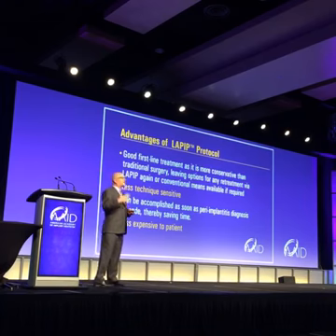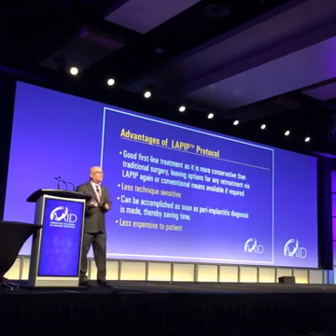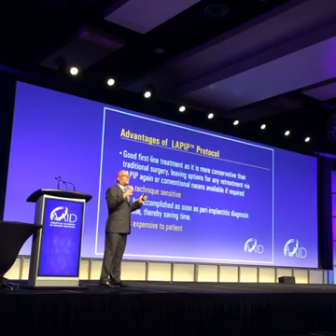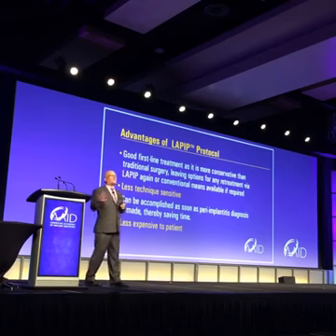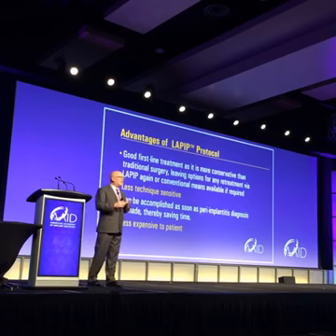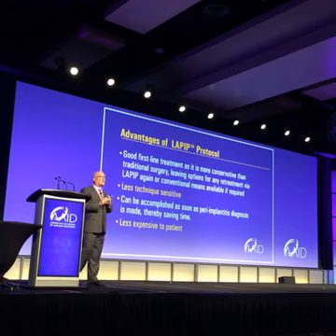It's more conservative than traditional surgery, so you have options for retreatment because you're not removing gum tissue. You're not flapping it. You're not removing granulation tissue. You're just keeping it very conservative. So you have the option. If you need to take the implant out, you can. If you want to treat it by conventional means, you can. If you want to treat it again by LAPIP, you can. Options, options, options, which we're always looking for.